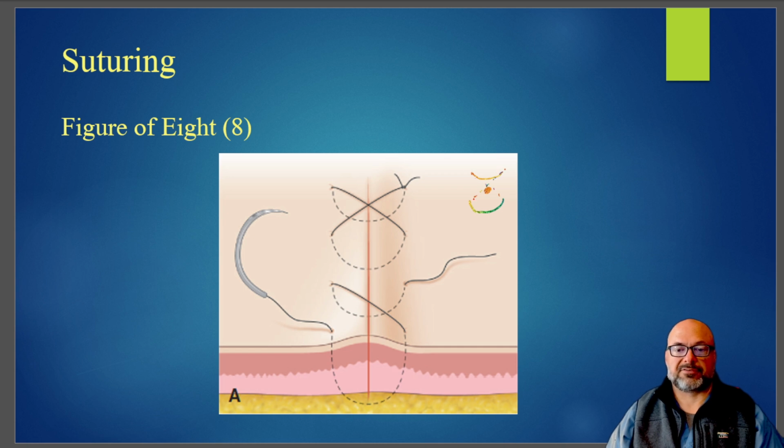So you get this X, or this kind of cruciate structure to the suture that's really going to compress across in both directions, perpendicular to that. So that's what this is demonstrating here. They would have entered here, come down, and popped out here, and then you just bring the needle across, pop in here, travel down, pop out here, and then tie it across that way.